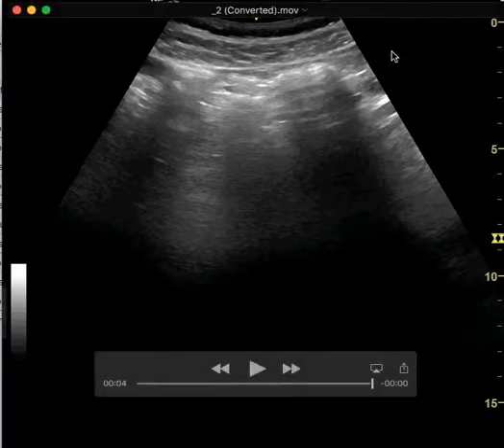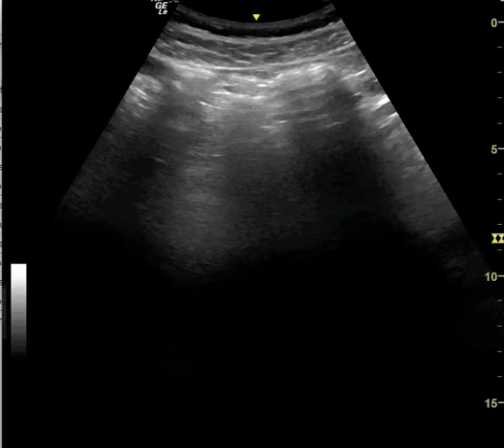The main take-home point is that when you do ultrasounds of the gallbladder, the kidney, or anything that's a 3D structure in the body, I need to see two planes. That's the main take-home point from this video.